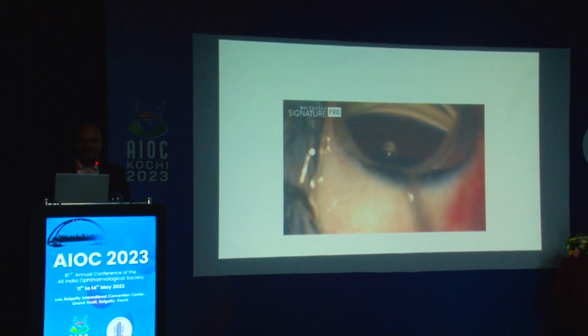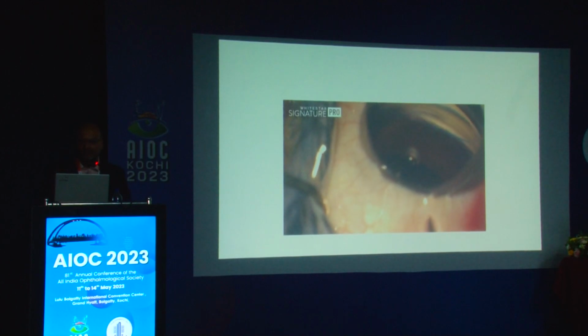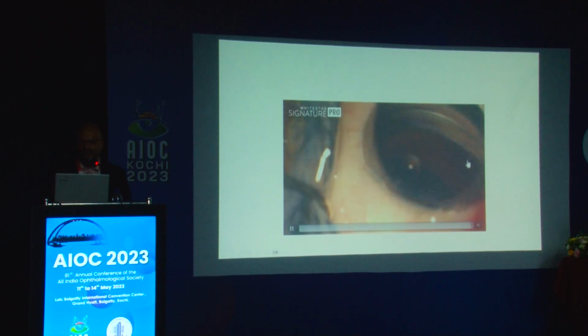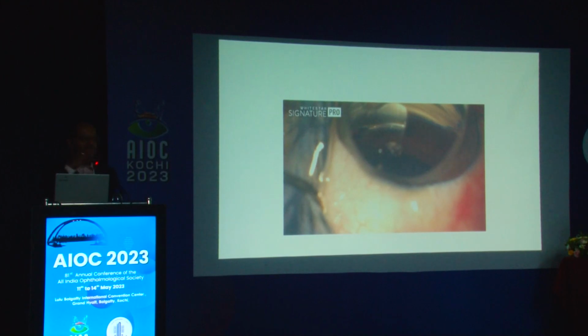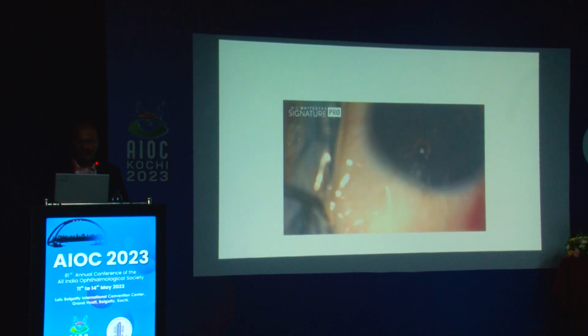It depends. Sometimes I feel that it's mainly because of the umbrella tip. You can see the suture there, just past. So it's mainly because of the umbrella. If the umbrella is kinked at an angle, then it can tear inside. So make sure the umbrella is correctly perpendicular to the suture stem.